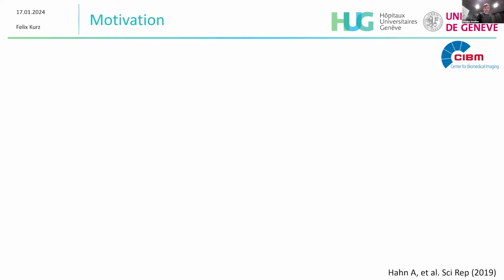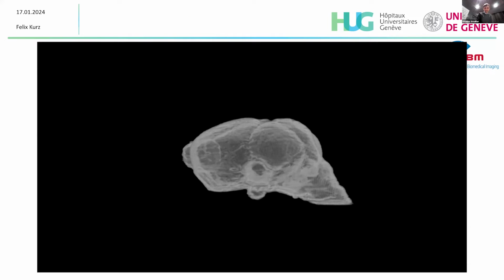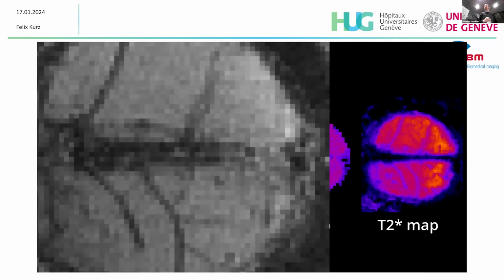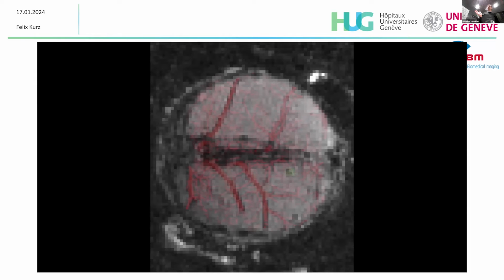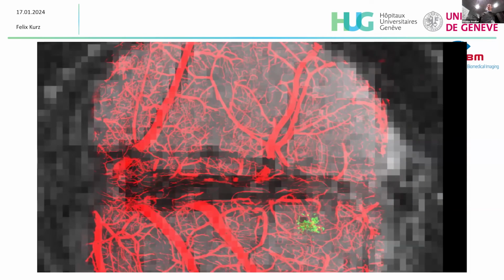This gives us the opportunity to see the video again. Then we see in green, as I said, the tumor cells and the signature that we expect from the mapping sequences. So we have a quantitative correlate of the actual position of the tumor cells. So this may aid in radiomics and quantitative computational based methods.